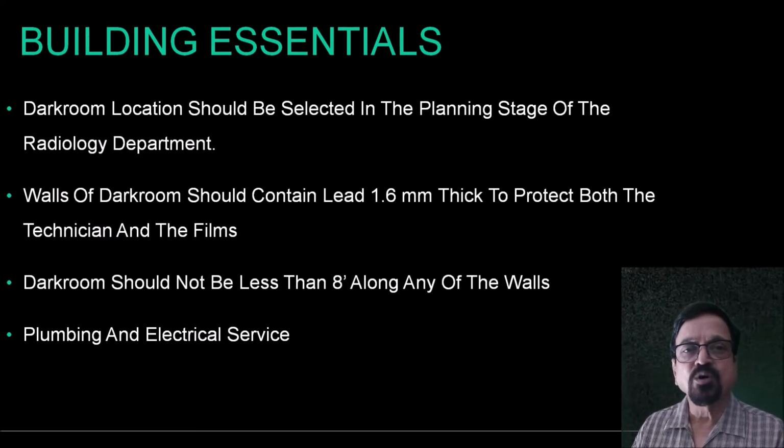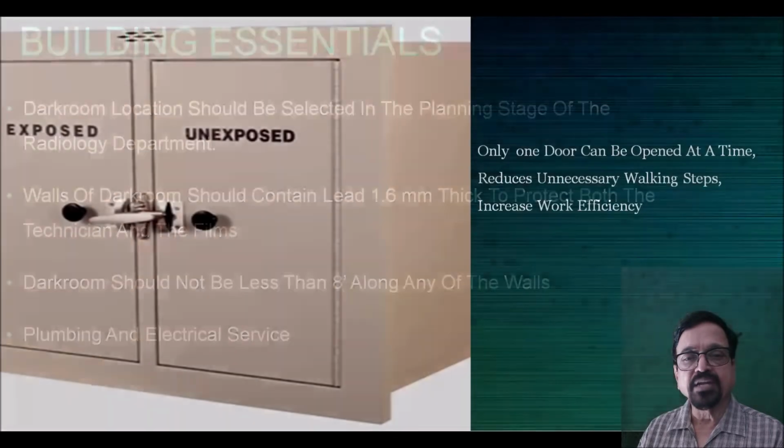The plumbing is because it continuously needs running water. If this is hampered in between, we will get stagnation of water, which will result in bad quality films.